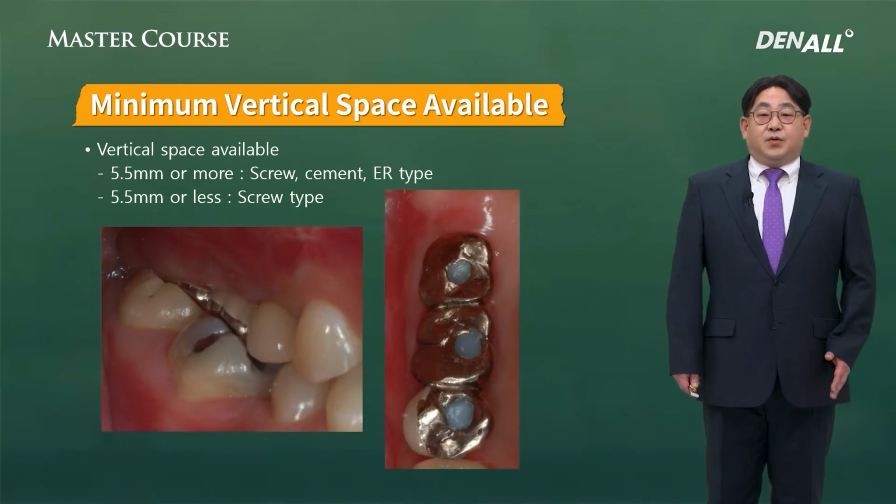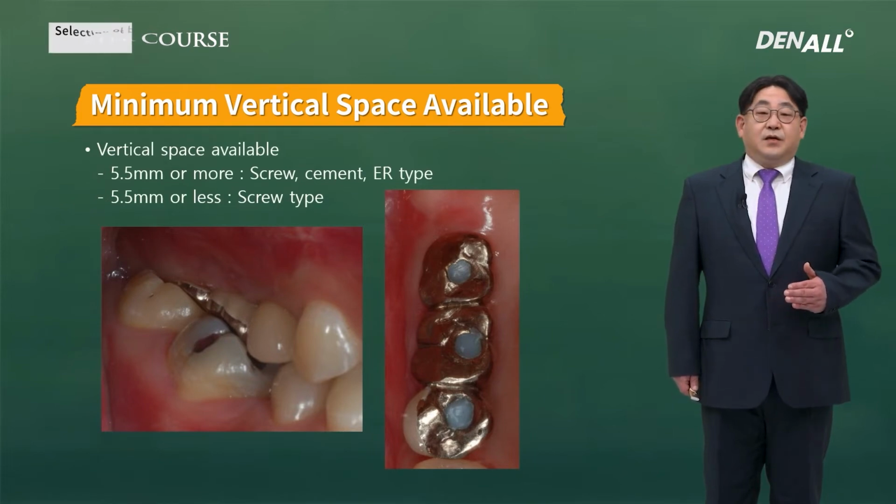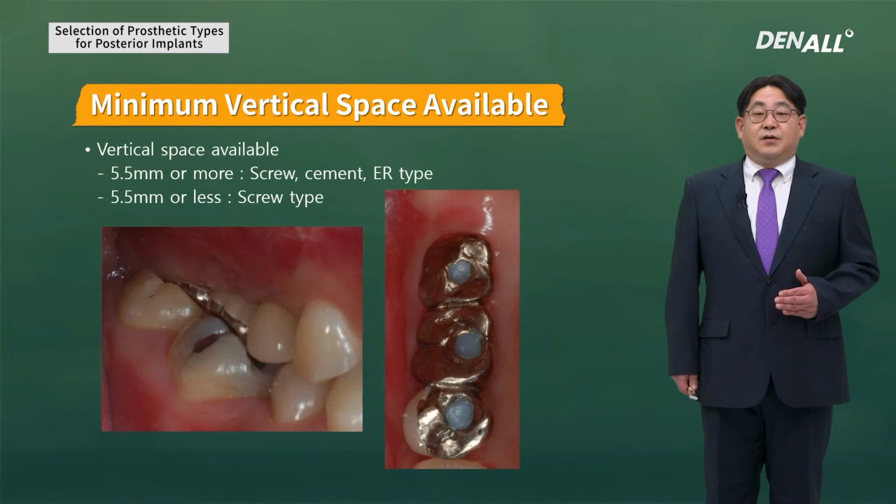I'm sure you'll get the gist if you look at this clinical image. The height is so tight that it is not enough to do final sealing. In this prosthesis type, if I had provided cement-retained prosthesis, this is not going to last long.